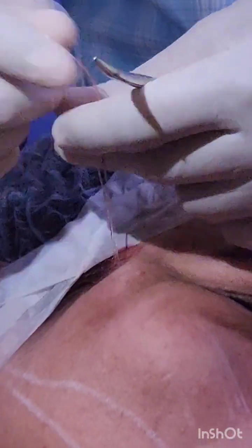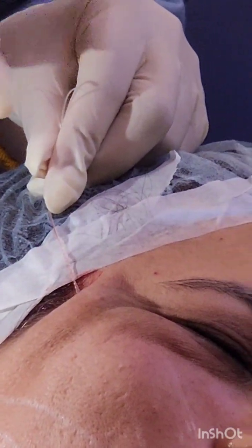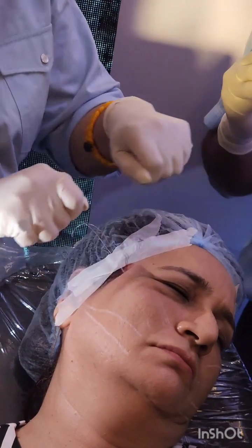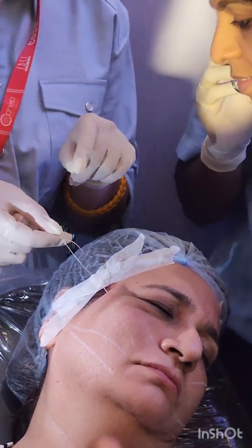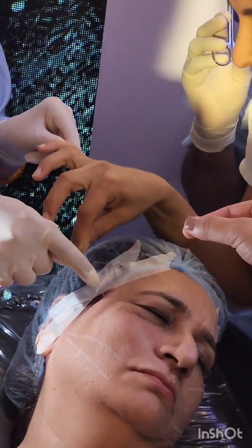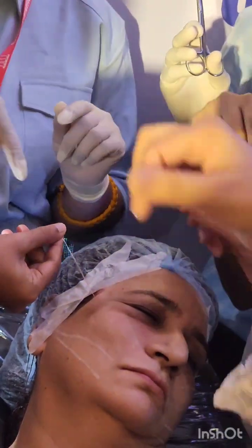Oh, nice. Nice. So, do you see that? Okay. So that will give us anchoring over here and most of the fibrosis, because you have interlocked threads over here, doing this intertwine inside. He was creating pressure here. Okay, so I'll let you touch. Don't touch it here. Touch it here. You can touch it, and you can see the pressure is here. When you pull it, can you see the pressure is here, not over here. Can you see the pressure?